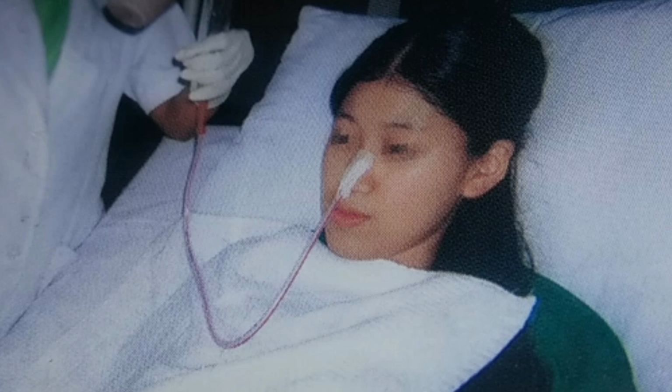After that, attach the syringe to the nasogastric tube. We take a 50 ml syringe and attach it to the nasogastric tube. Aspirate the stomach content. Why are we aspirating? Aspirate means we are taking some food item or fluid from the stomach. We have to do aspiration.